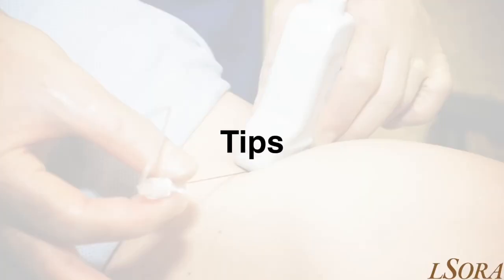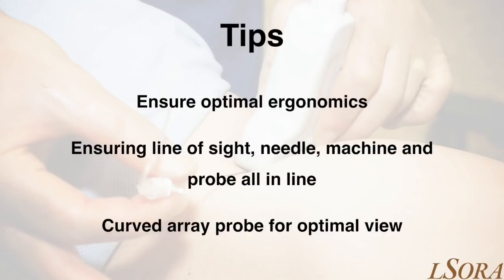We'd like to share some pearls with you for performing a quadratus lumborum block. As always, please pay attention to ergonomics. Allow yourself, the machine, and the needle all to be within the direct line of sight. It is often easiest to use a curved array transducer to appreciate the surrounding anatomy much clearer.